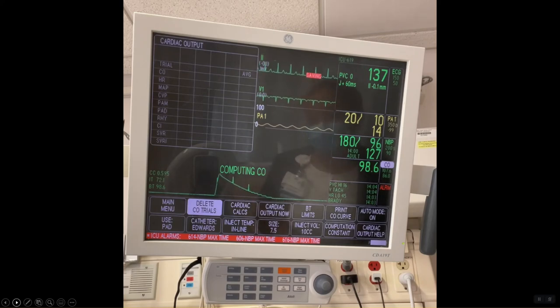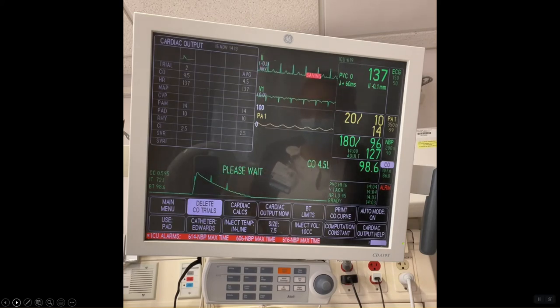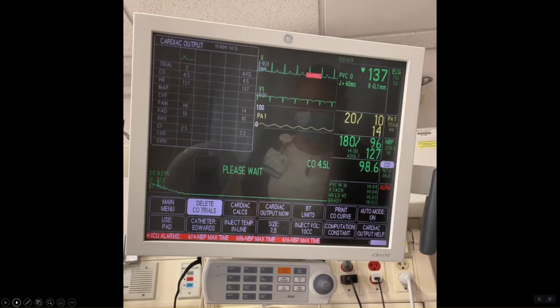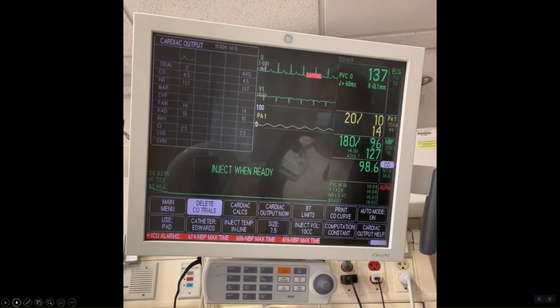If you get an erroneous value, you may delete that trial by selecting the trial you want to delete and selecting the delete CO trials button on the screen. The monitor will average out your trials and display the value. Now you have your averaged cardiac output measurement.